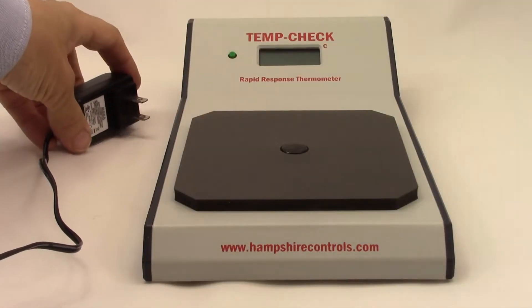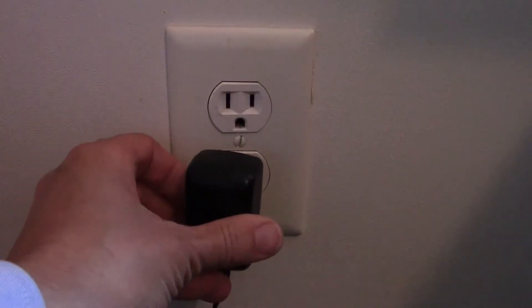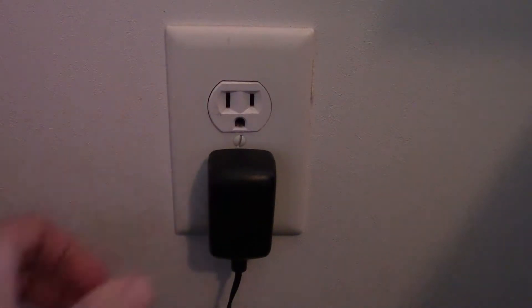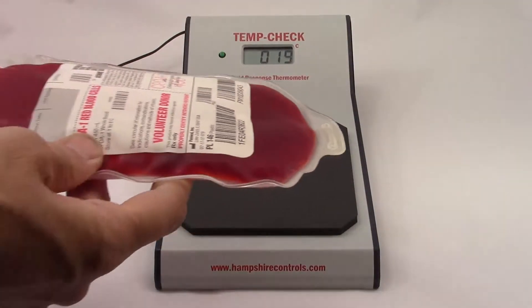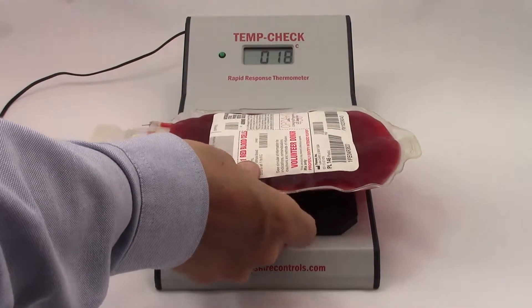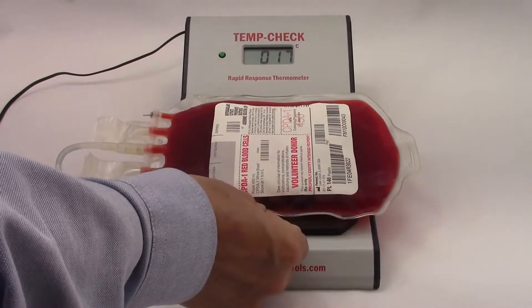To operate the unit, plug in the 12-volt power adapter into the standard 120-volt electrical outlet, then place the item to be checked in the center of the insulated pad. The readout response is typically within 15 to 45 seconds.